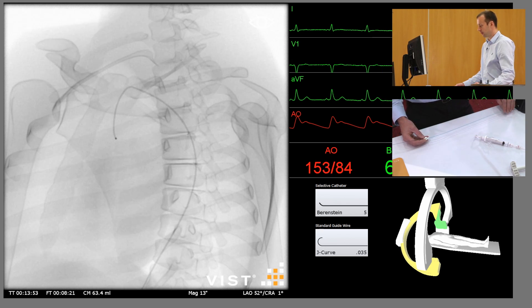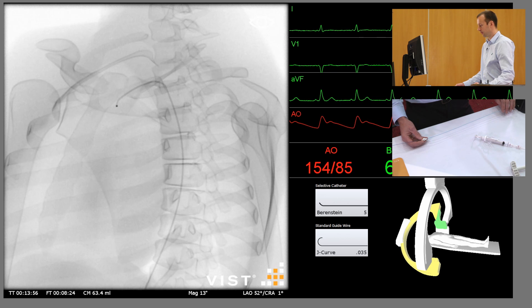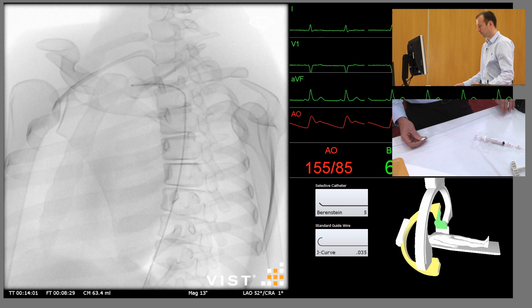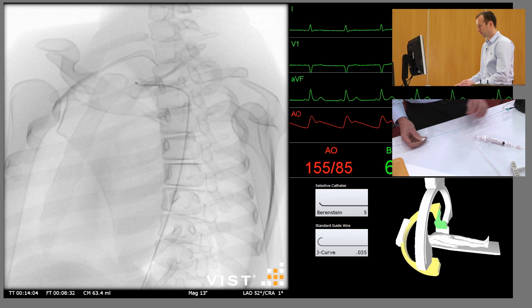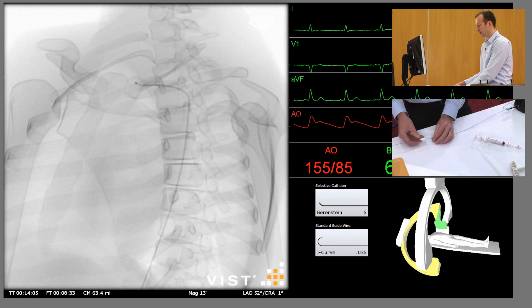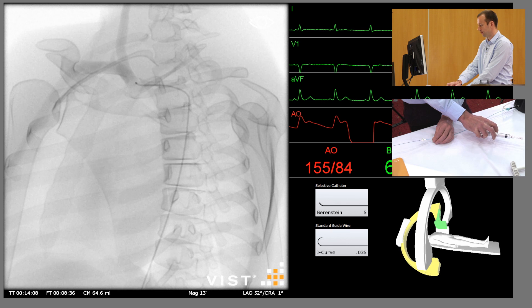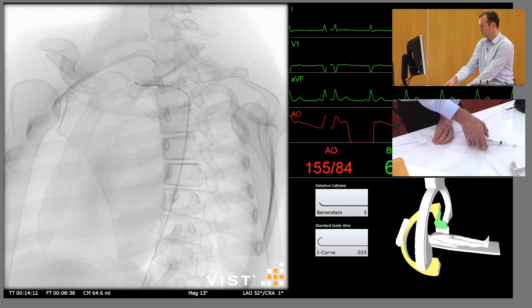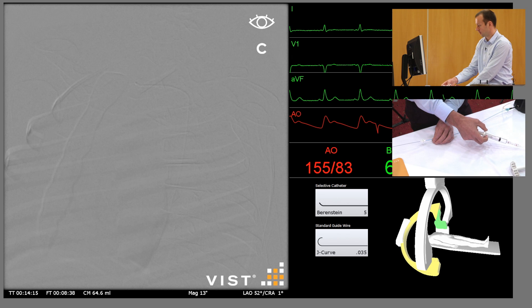Remove the guide wire. As we withdraw the catheter, just gradually turn it through 180 degrees so we engage the origin of the innominate artery. Again, we can confirm that with a little contrast injection, and we can do a subtracted run for the best possible imaging.